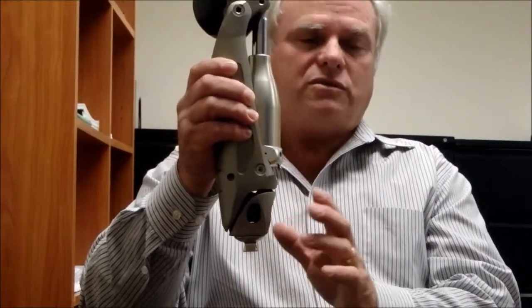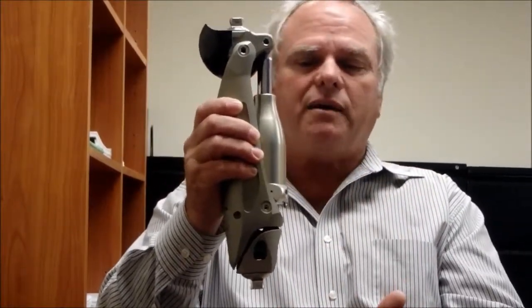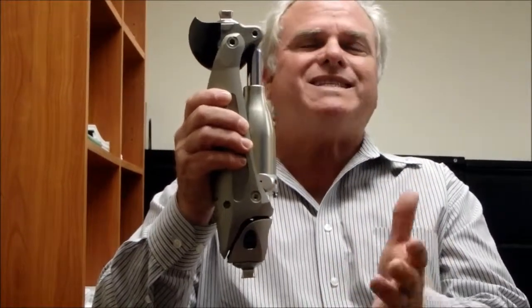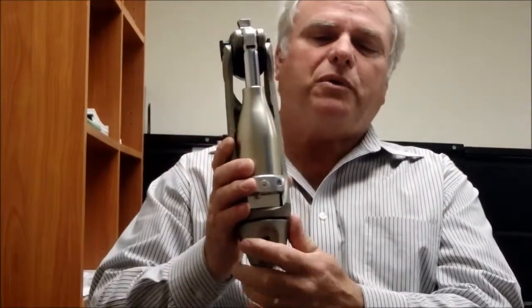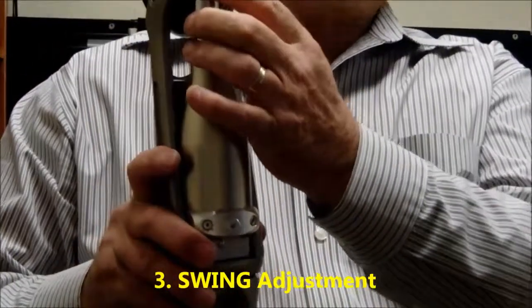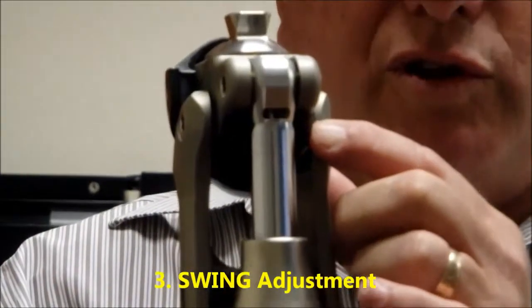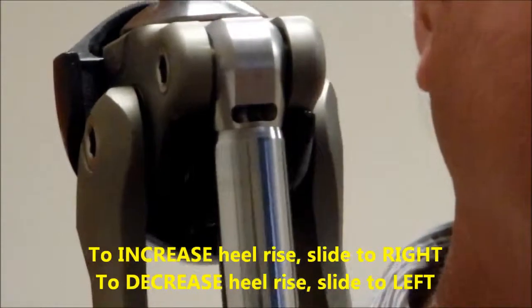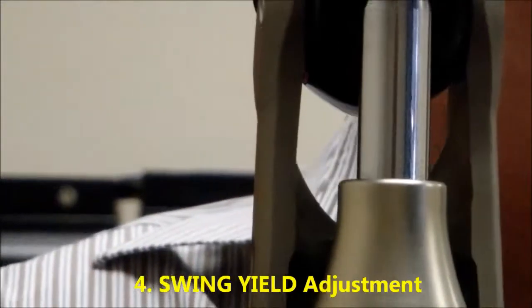So now we have this set, the toe load is correct, and they're walking and initiating swing — they're getting swing to happen. Now we need to know: is the swing resistance high or low? What do we need to get proper heel height? Most people need, which is step three, to have this lever right here slid all the way over to the right. That should give the highest heel rise. Next is this stance or swing yield.